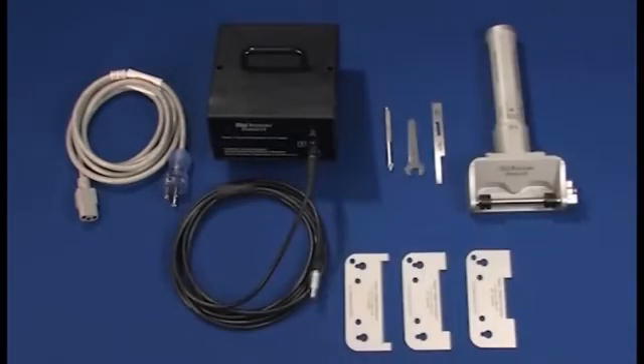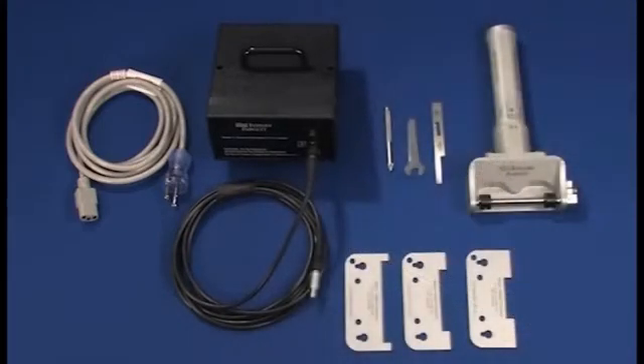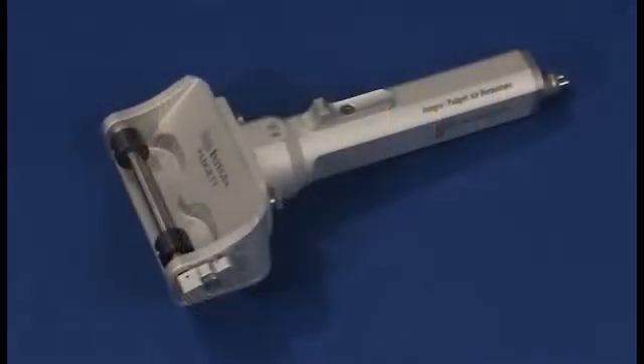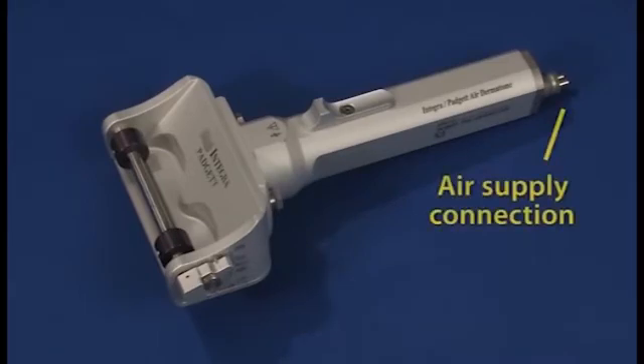In addition, a wider version of the Model S dermatome called the Model S6, which allows the user to harvest skin grafts up to 6 inches wide, is also available. While this guide features electric dermatomes, a 90 PSI air-powered dermatome called the Model C is also available. If you are using the Model C, simply connect the unit to the air supply and turn on the airflow to provide power to the unit.